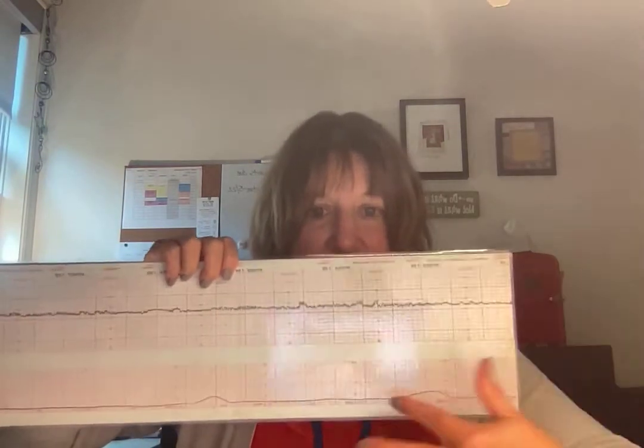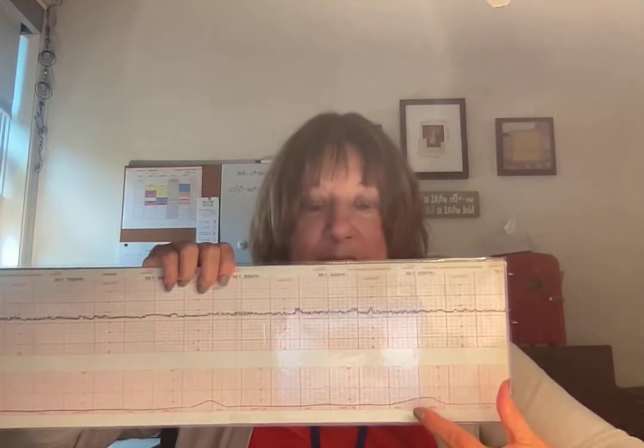So right here I have this little strip. The top channel right here is the fetus. The bottom channel right here is the uterus. Okay? So that is part of that. So we're going to be looking at baseline, we're going to be looking at variability, and we're going to be looking at accelerations and decelerations.